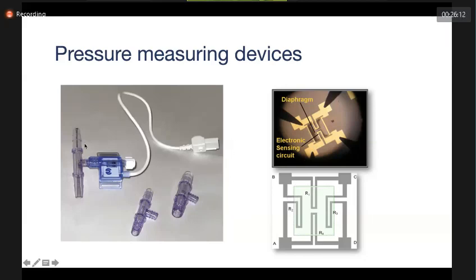So what will happen? The kinetic pressure, hydrostatic pressure, which is coming into the catheter system, into the three-way, directly goes and hits this diaphragm or membrane here. That will go into these resistances or electrical strain gauge, where the hydrostatic kinetic pressure will move the resistance and be converted into electrical signals.